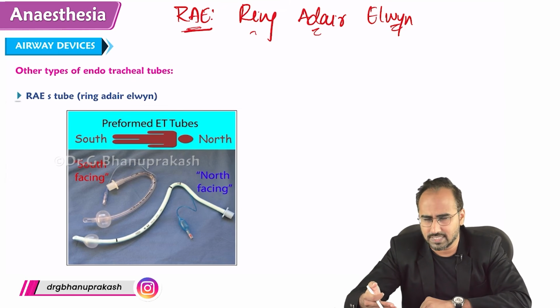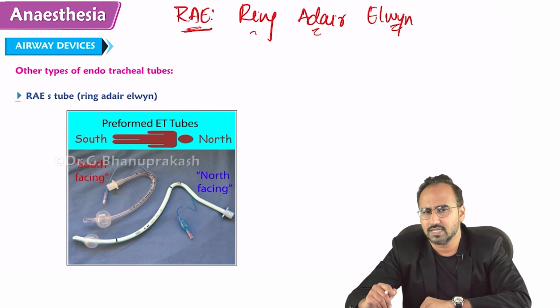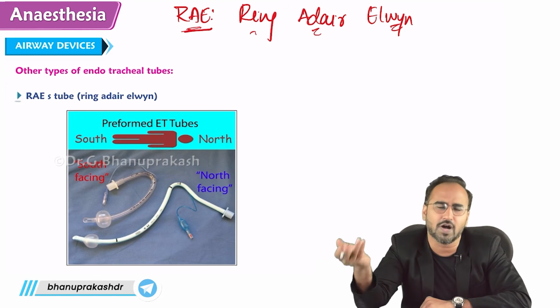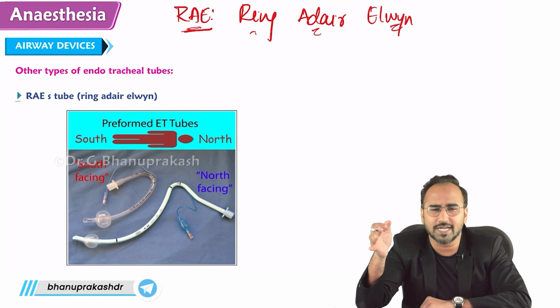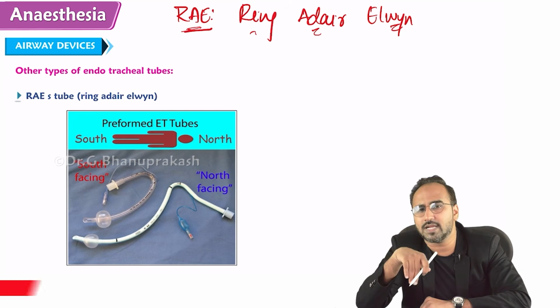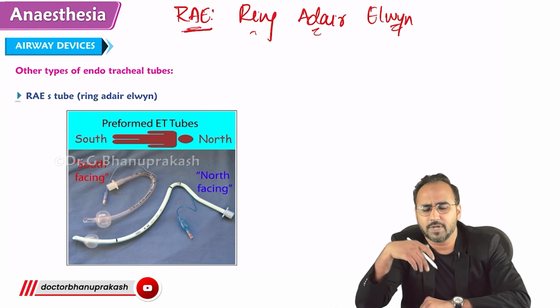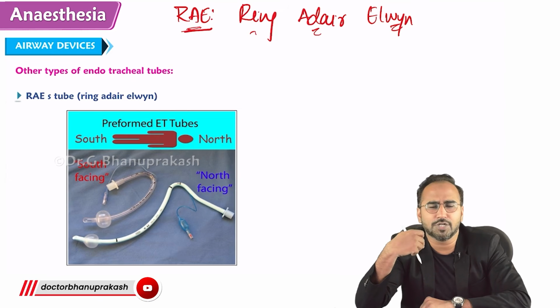He will be asking us, what anesthesia will you give for the removal of this cancer? Come on, guys. It's an oral cavity, above umbilicus, major surgery. You have to go for general anesthesia. You will tell me general anesthesia. I will tell you what? Okay, go for general anesthesia, but don't put the endotracheal tube orally. Why? Because if you put the endotracheal tube orally, I won't be able to do the surgery.